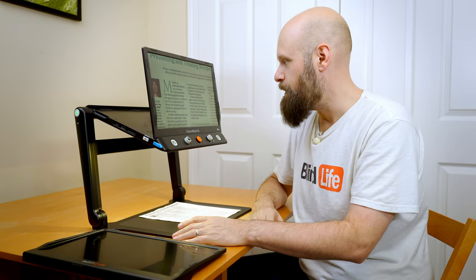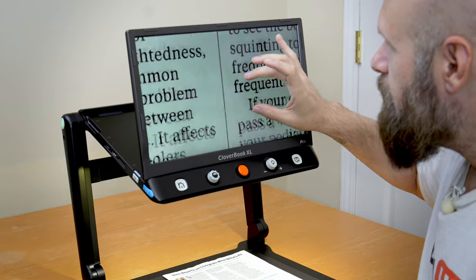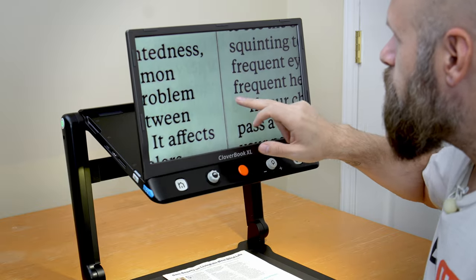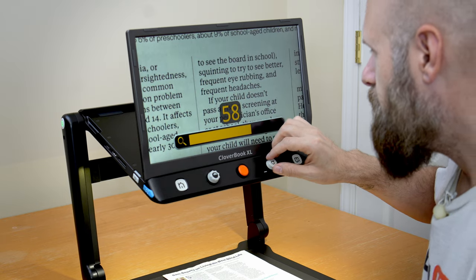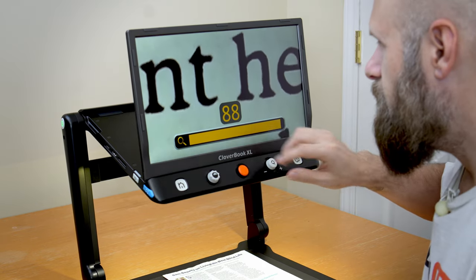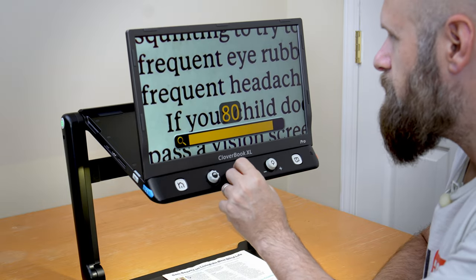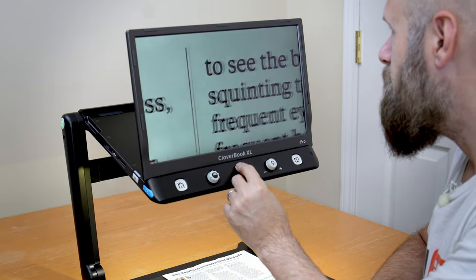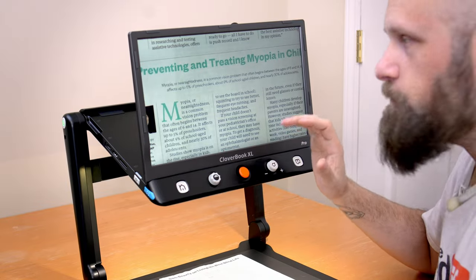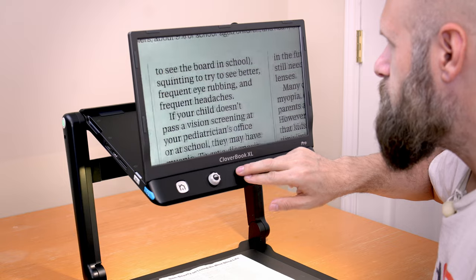Any portable video magnifier needs to be able to magnify an image, and we have two ways to do that here. You have a touch screen so you can pinch to zoom and move the image around. We also have a dial that allows us to zoom in, and we get audio cues when we've reached maximum and minimum zoom. There's also a joystick in the middle that allows us to move around the image very responsively.